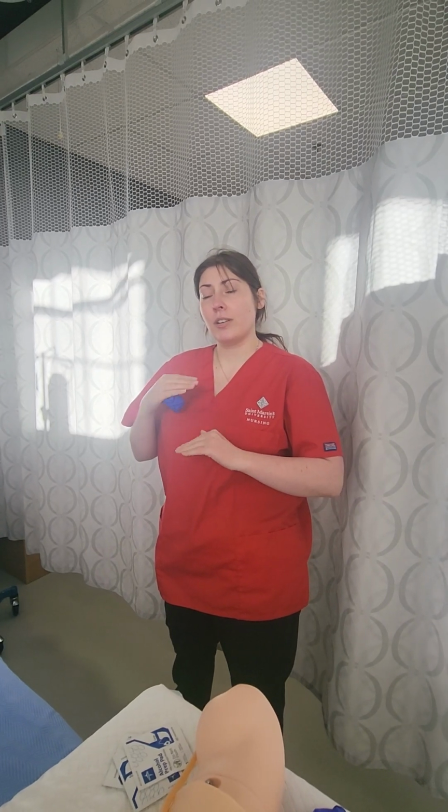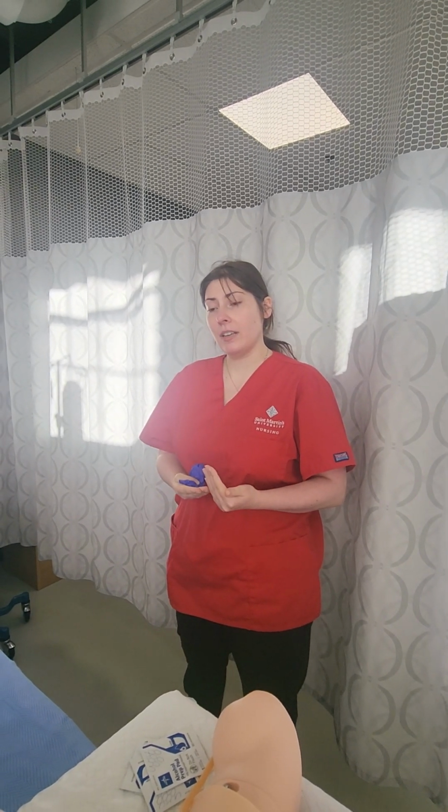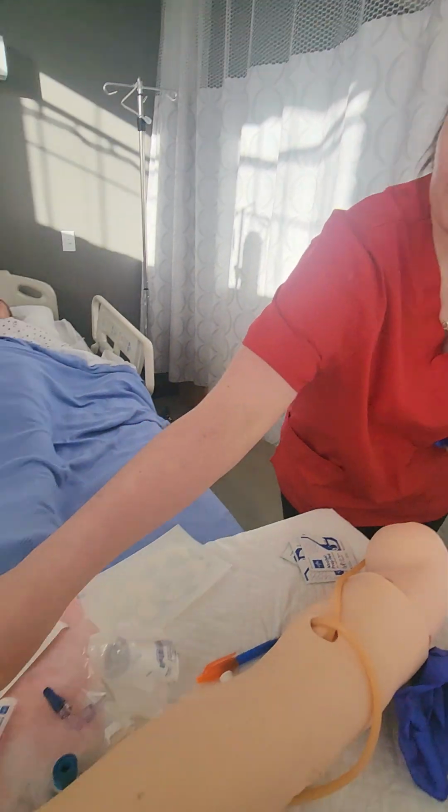today for Mr. Scott. First I want to go to my MAR and double check that I have the correct drug and the correct orders for this patient, as well as double checking their allergens, and make sure it's the correct drug that they need. The morphine is what I'm going to be giving, and this drug is here.